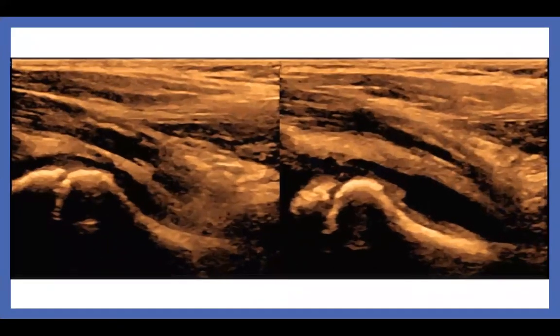So you look at one side. Of course, you label it right, left, sagittal right, sagittal left, and then in this situation you can see there's some fluid there. Surely there's some fluid. The question is, is the fluid we see here abnormal? Is it normal? Remember, if the thickness of the capsule is less than 5 millimeters, you're fine. Usually, between normal and abnormal, you'll see at least a 2 millimeter or higher difference between the two. That's a good number to remember: a 2 millimeter difference between the two sides.